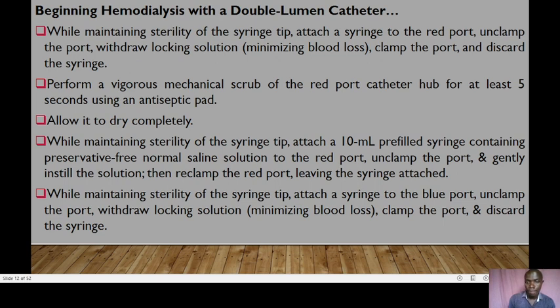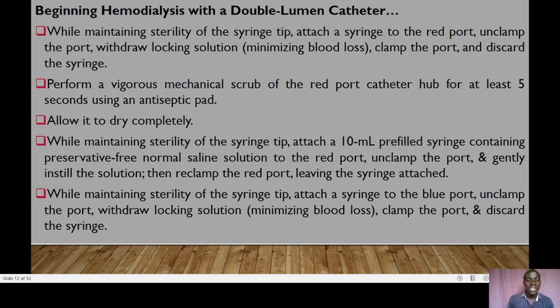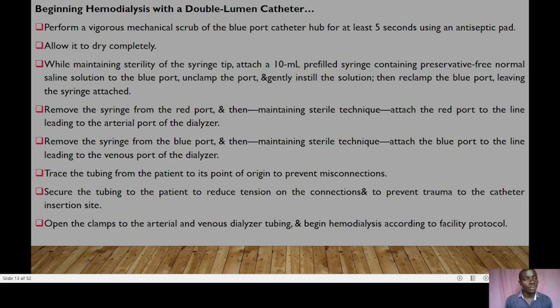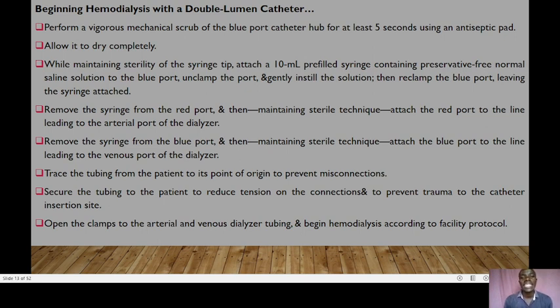While maintaining sterility of the syringe tip, attach a syringe to the red port and unclamp the port; withdraw the locking solution to minimize blood loss. Clamp the port and discard the syringe. Perform a vigorous mechanical scrub of the red port catheter hub for at least five seconds using an antiseptic pad and allow it to dry completely. Attach a 10 ml pre-filled syringe containing preservative-free normal saline to the red port, unclamp and gently instill the solution, then reclamp the red port leaving the syringe attached. Repeat the same process for the blue port: attach a syringe, unclamp, withdraw the locking solution, clamp and discard the syringe, scrub the hub for five seconds, allow to dry, attach a 10 ml saline-filled syringe, instill the solution, and reclamp the blue port.